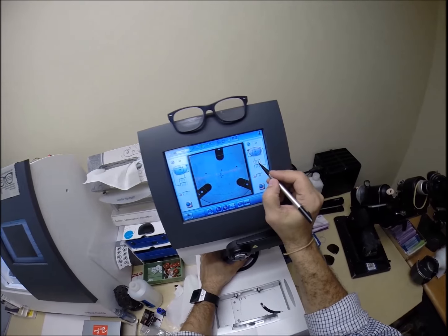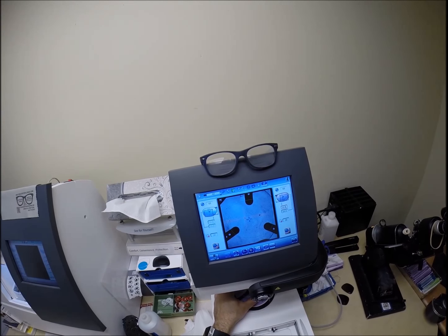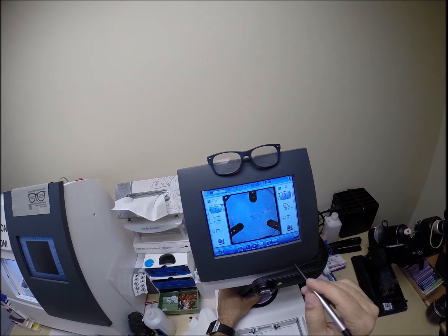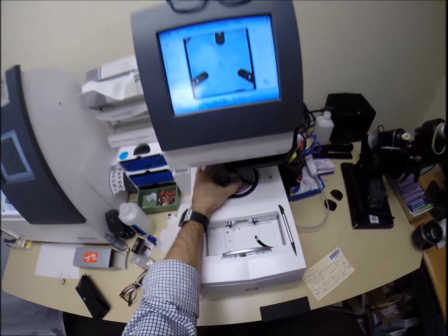Pull the paper away to make the black side sticky. Same pupillary distance for your left eye. It has mirrored the right, same optical center height. And line everything up perfectly. And hit that button. The arm comes down and places the block onto the left lens.